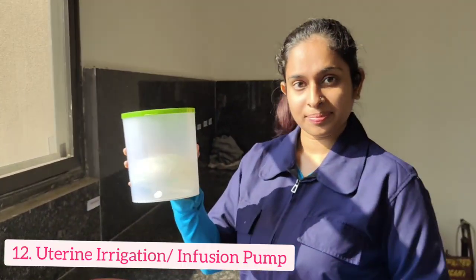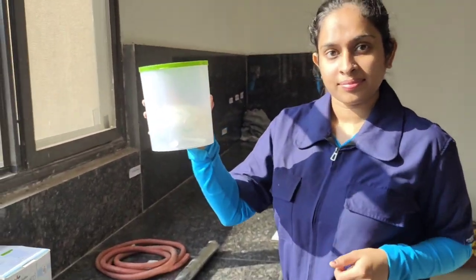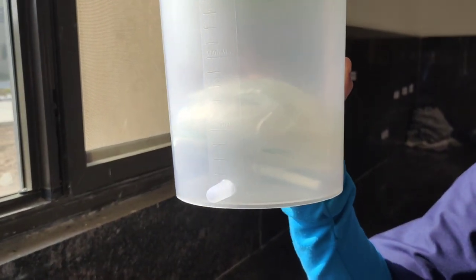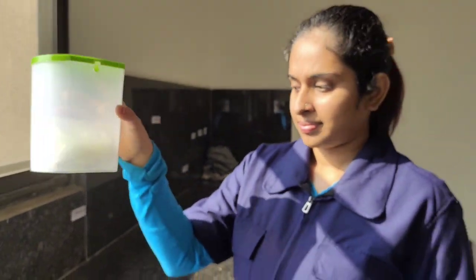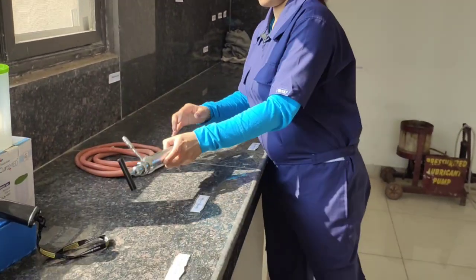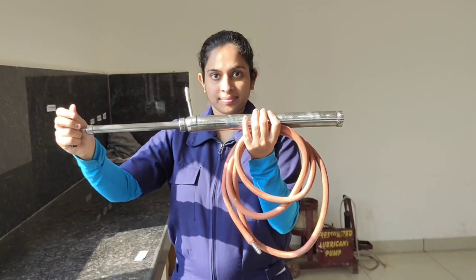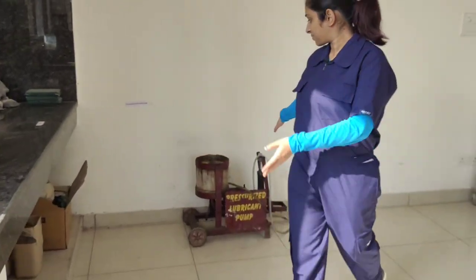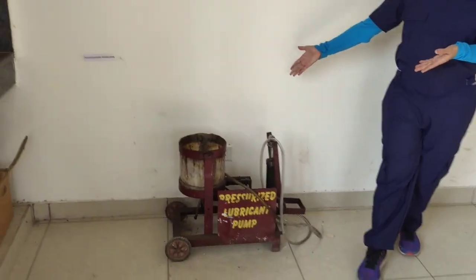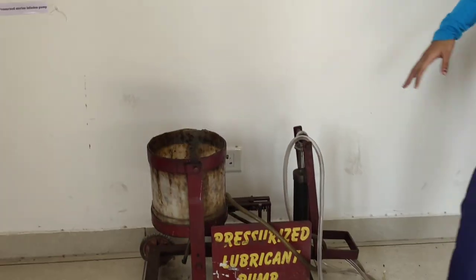The next instrument is called the uterine irrigation or infusion pump. This instrument is used when a large amount of solution is required to be added to the uterus — for example, in cases of long-standing dystocia when the birth canal is extremely dry and a high quantity of lubricant is required. Finally, we have the pressurized lubricant pump or pressurized irrigation infusion pump, which has the same function as the uterine irrigation pump.